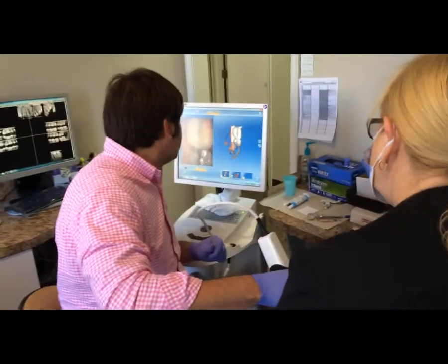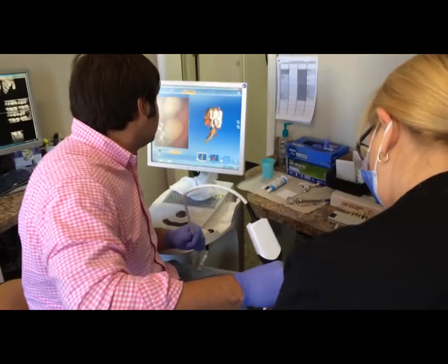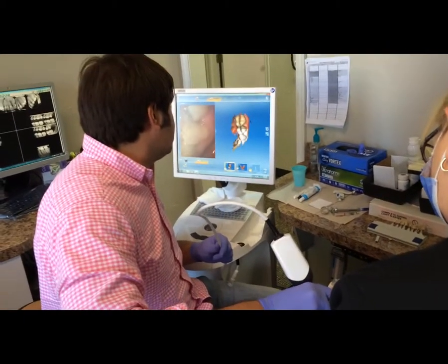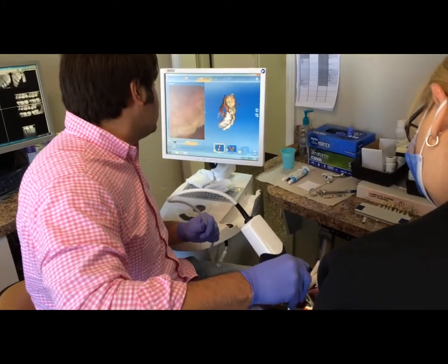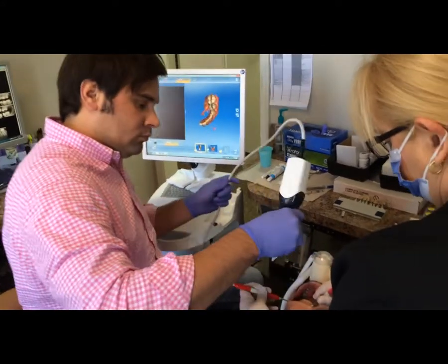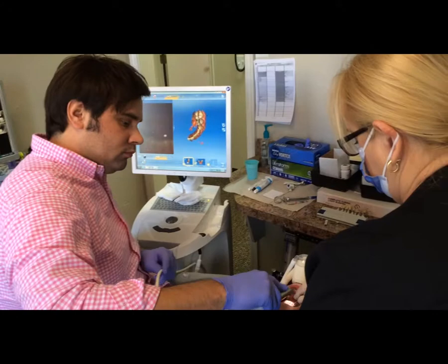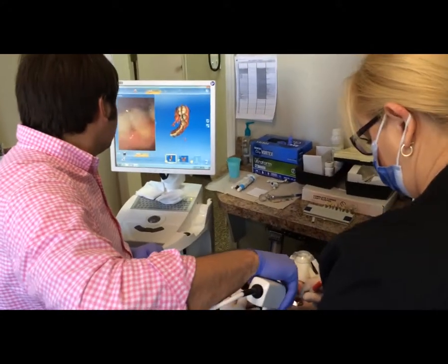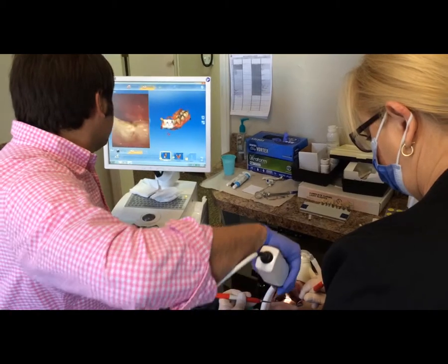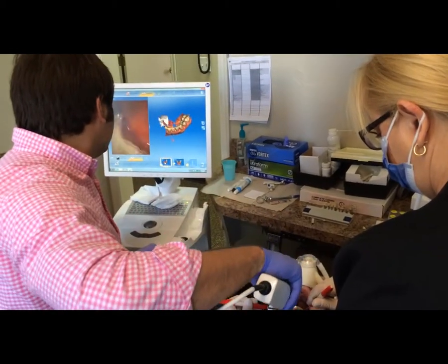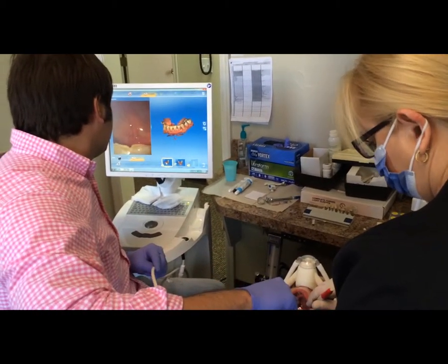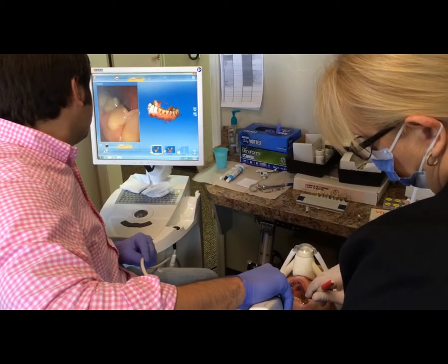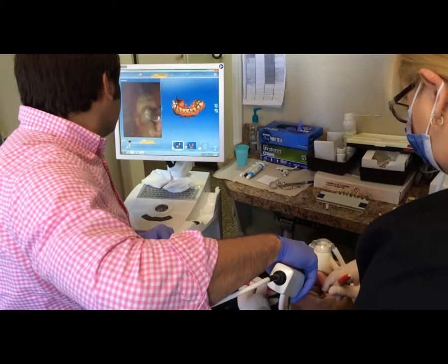Now he is moving on to the other jaw. He starts posteriorly, scanning on the occlusal surface, coming around to the buccal, flowing to the lingual, across the incisal edge, and flips the scanner around to get the proper angle. He then goes back along the lingual and buccal edge, rotating over those teeth to get the proper incisal edging needed for the digital impression.